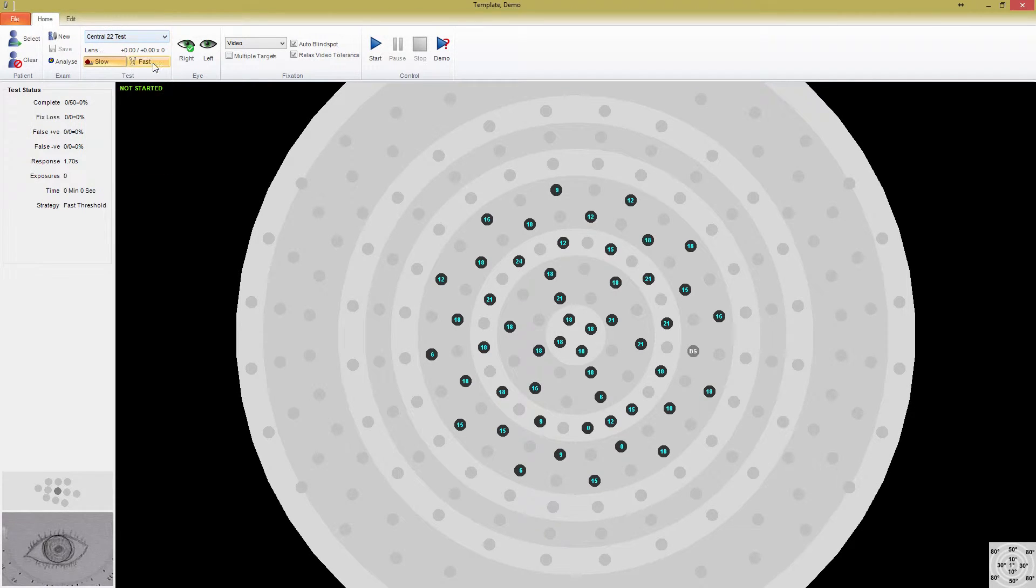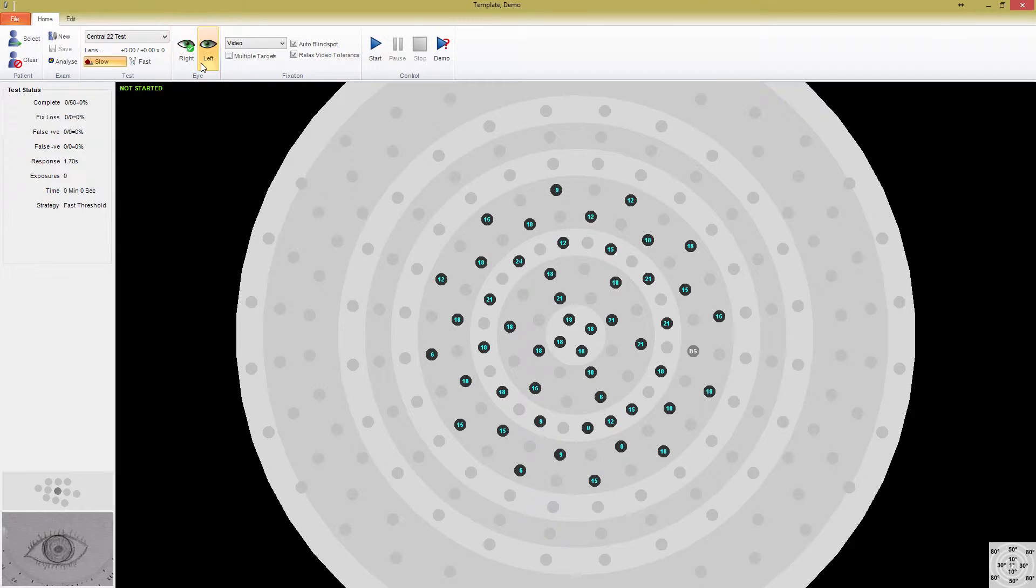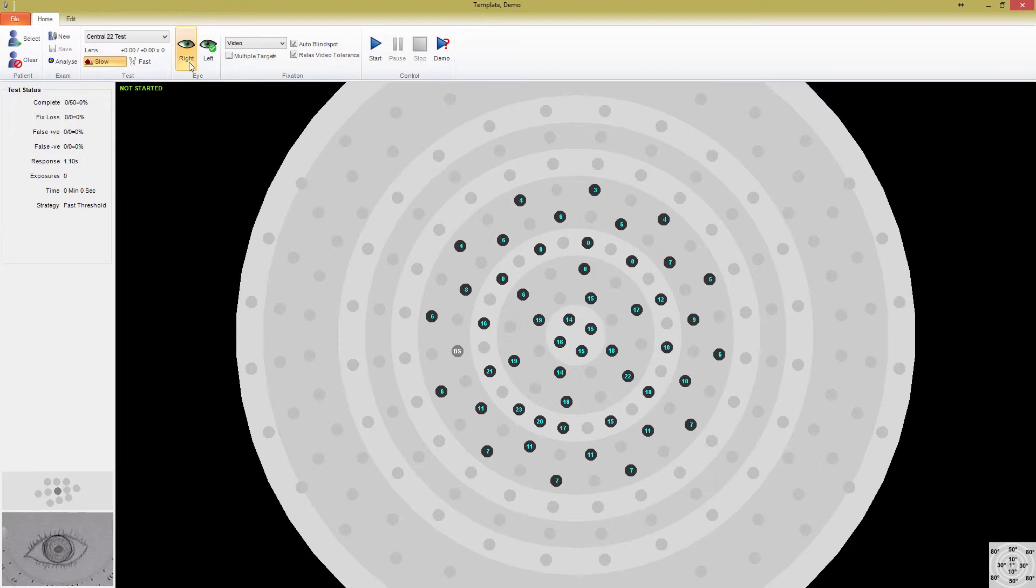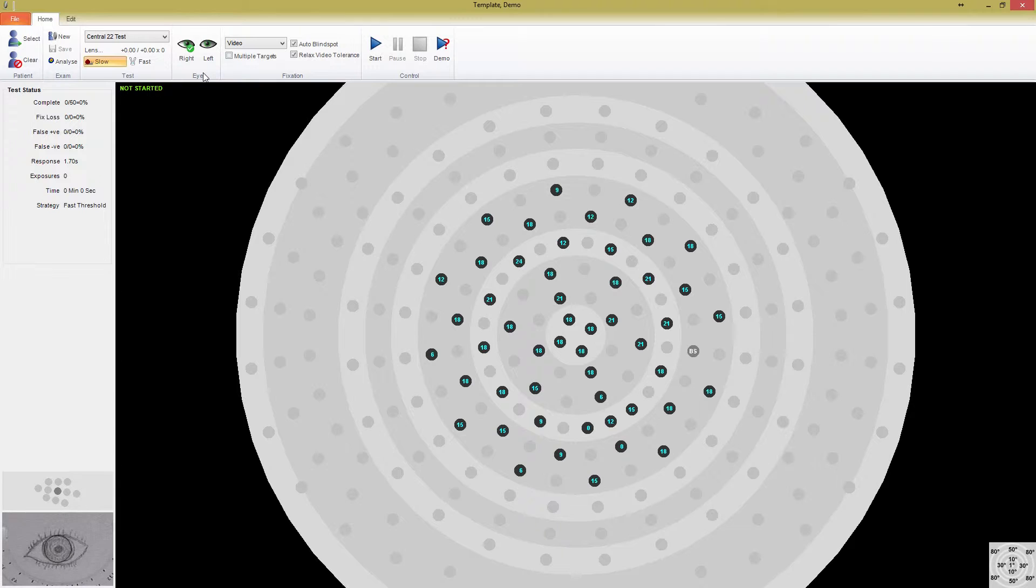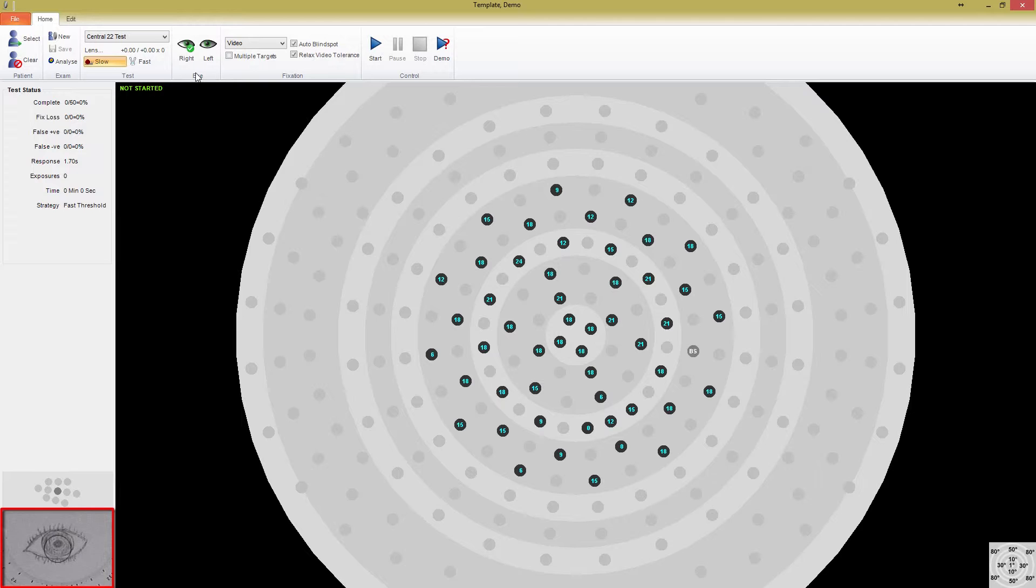The next panel you'll notice is the eye panel. Here, you can select which eye you want to test. Medmont will default to the right eye each time you open the test window. If you're running a binocular test, this option will be unavailable, as both eyes must be selected. If you're testing the right eye, put the occluder over the patient's left eye and their chin on the left side of the chin rest. Wind the chin rest up until the patient's iris is centered in the video window, which is in the bottom left of the screen.